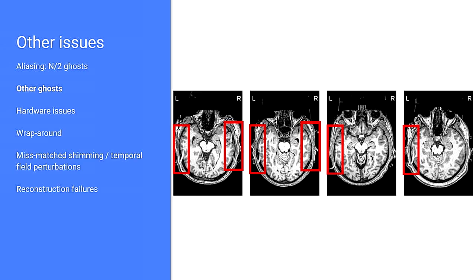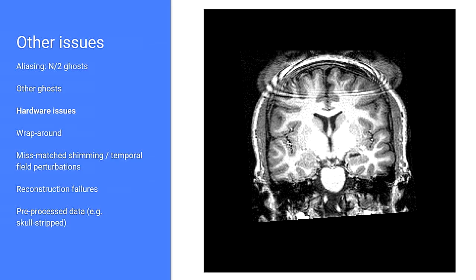Then other things may happen, like this is the DS30, the CNP dataset that Cameron mentioned. We found that there is a ghost. I don't know if you can see it there, but it seems like a ghost of the headset the participants were wearing is overlapping the gray matter. So this is probably going to break many of the FreeSurfer runs of this dataset.